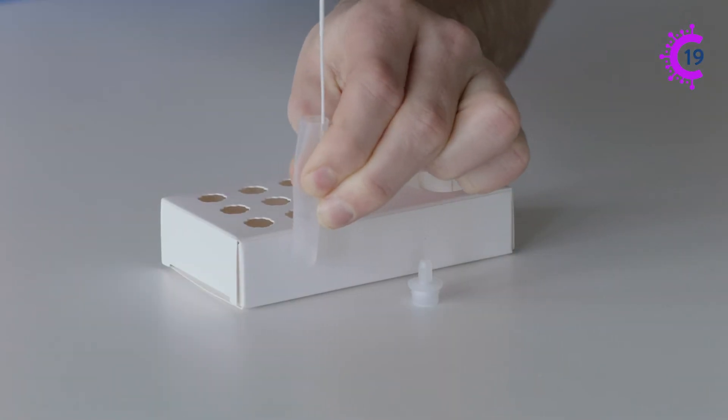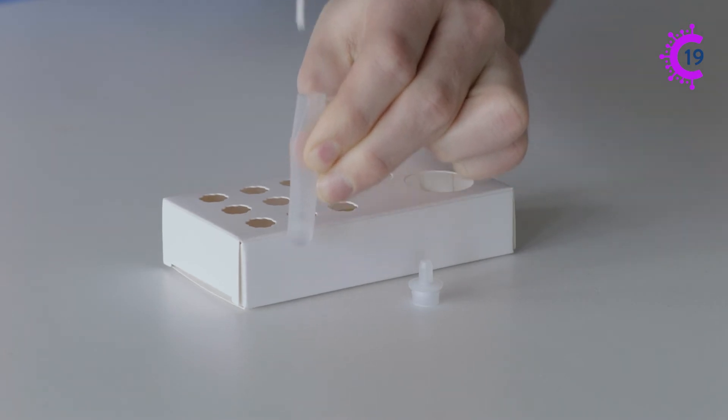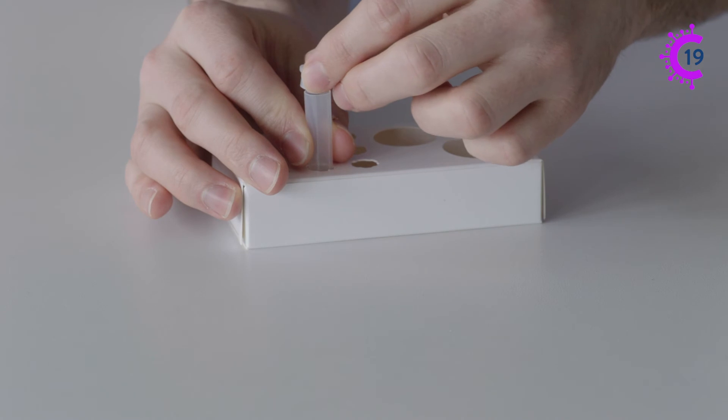Squeezing the outside of the tube with the fingers several times, remove the swab and discard it. Place the top of the lid firmly on the collection tube.